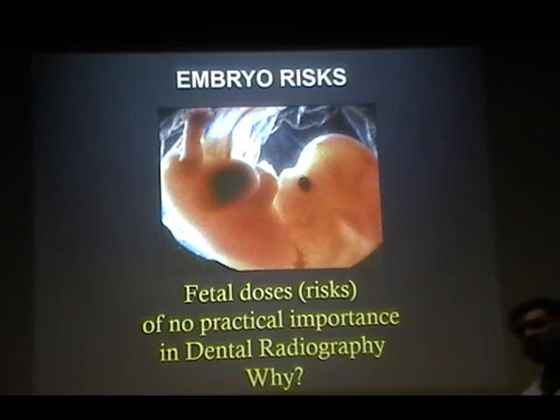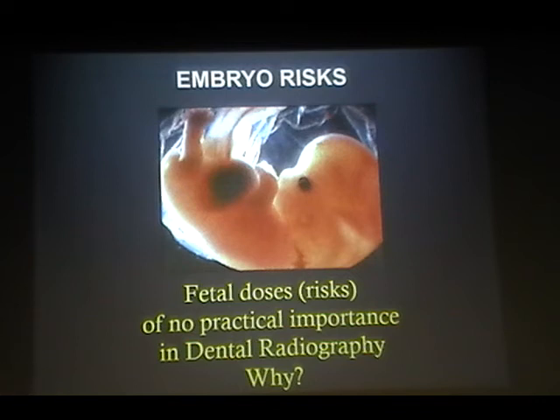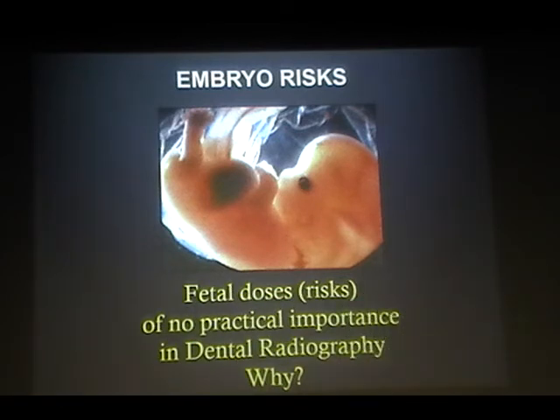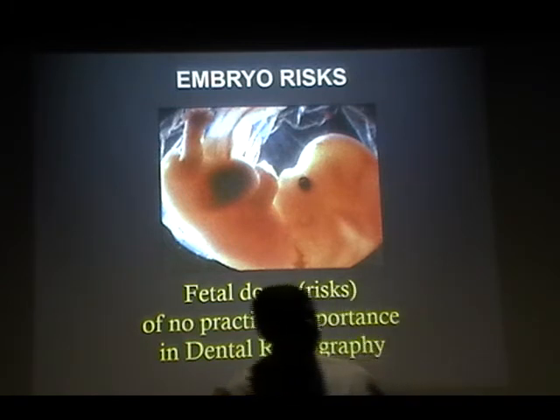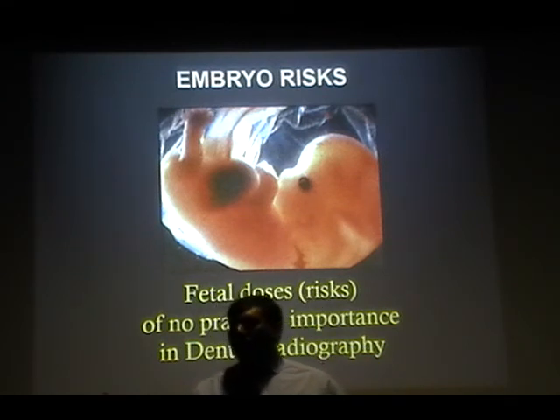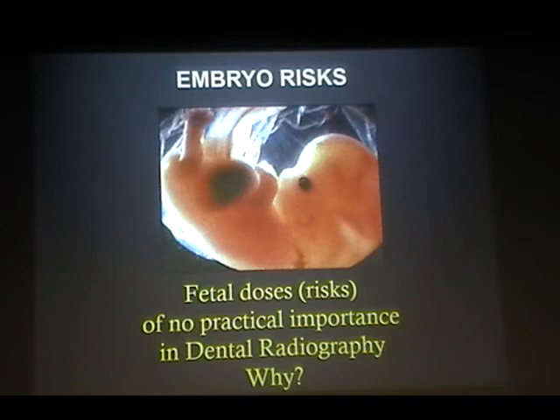So, if a patient comes to you and says that she is pregnant, do you get a radiograph or not? Put a lead apron on? Does that help? Depends on the trimester. You said a lead apron. Anything else? I would think it would also depend on the procedure.